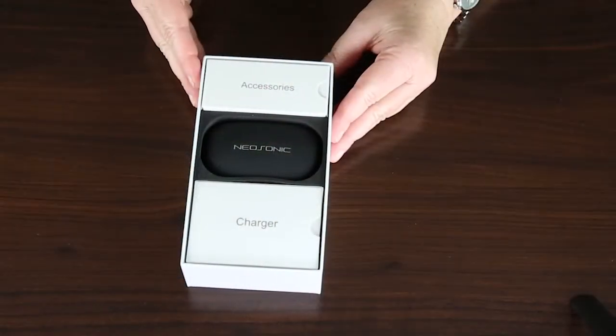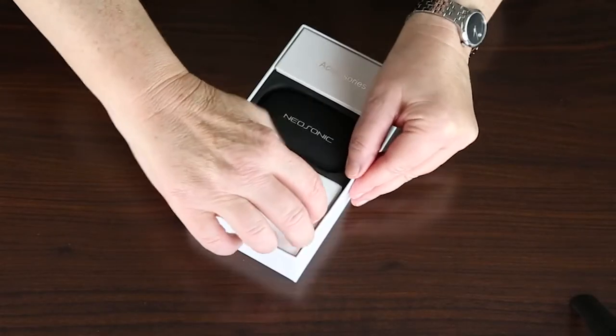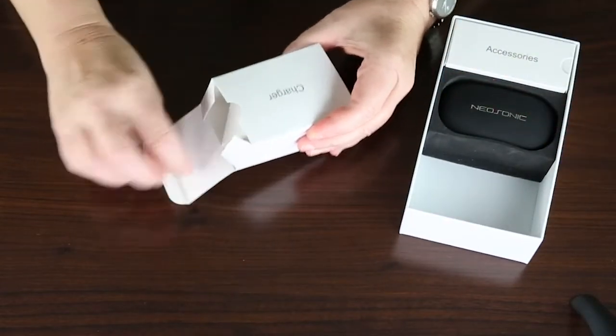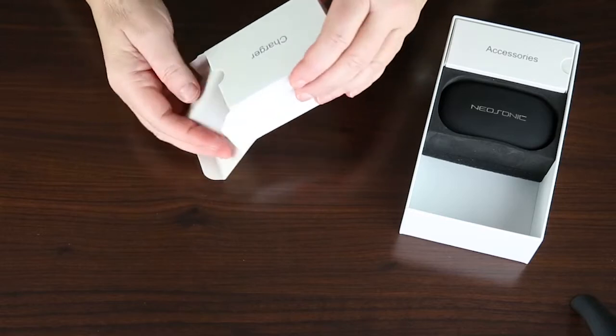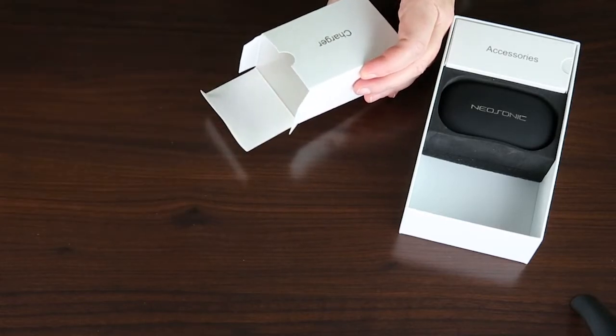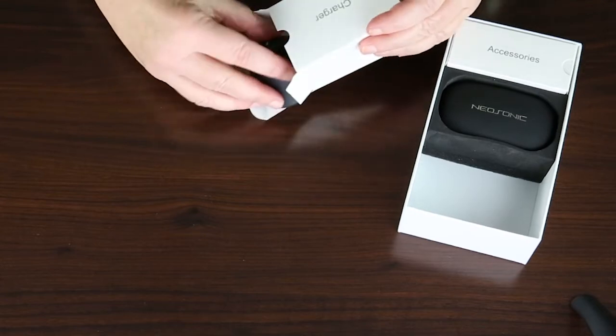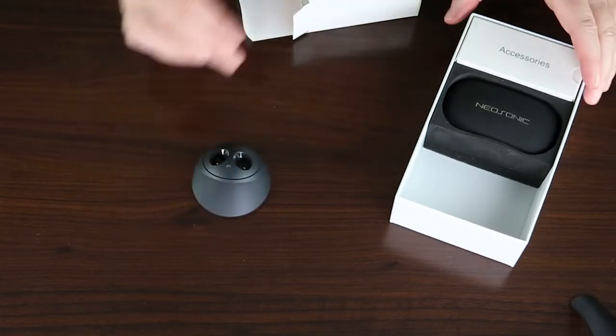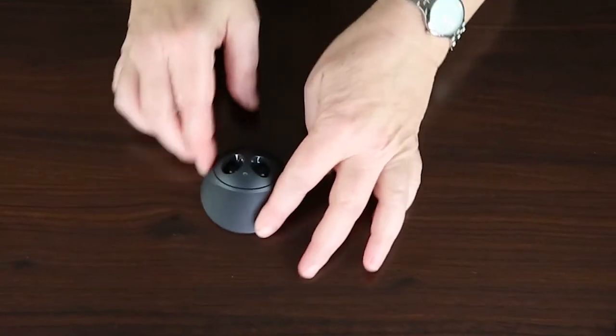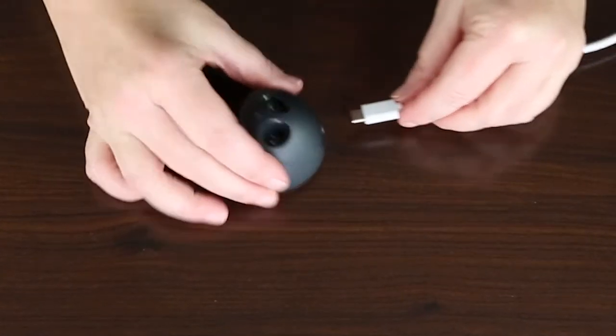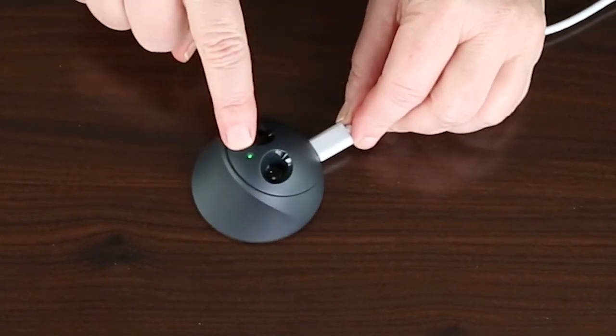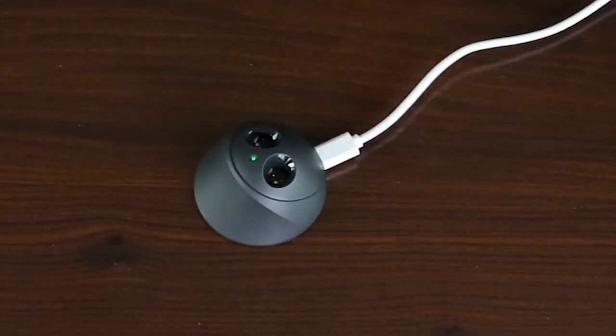Also included in your box, you have your charger. Your charger box looks like this. Inside you will find the adapter to plug into the wall. You will also find the actual charger base. This is where you will charge your hearing aids. When you plug in your base, simply plug in. You will know that you have power to it. There's a green light that lights up here.